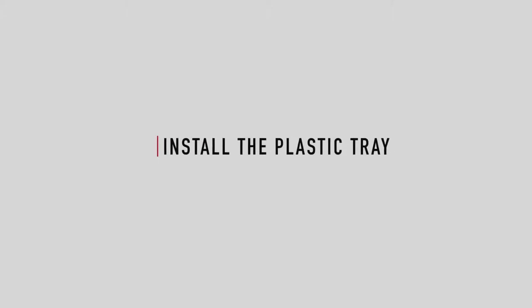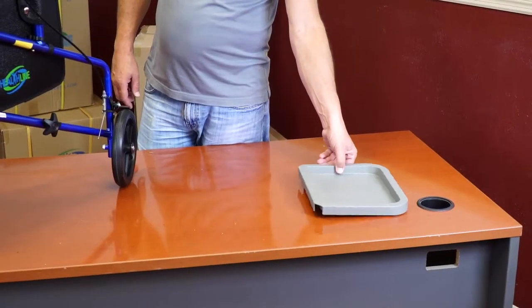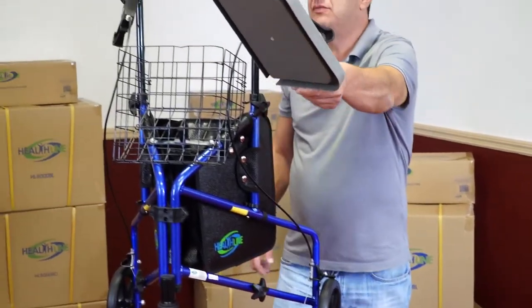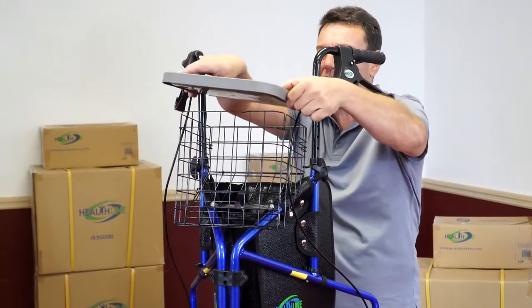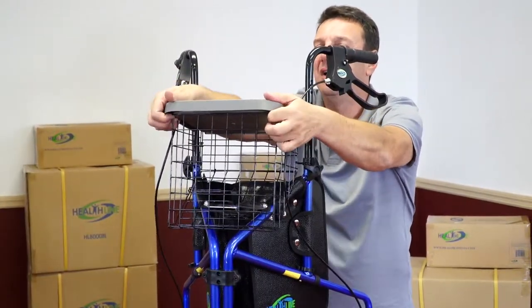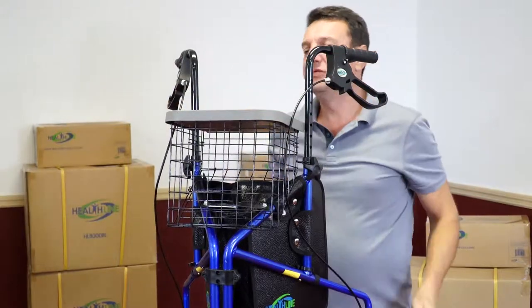Installing the plastic tray. Place the plastic tray on top of the basket. Make sure the rounded corners of the tray are facing forward and the grooves on the bottom of the tray are aligned with the top of the wire basket. Gently push the tray down until it snaps into place.